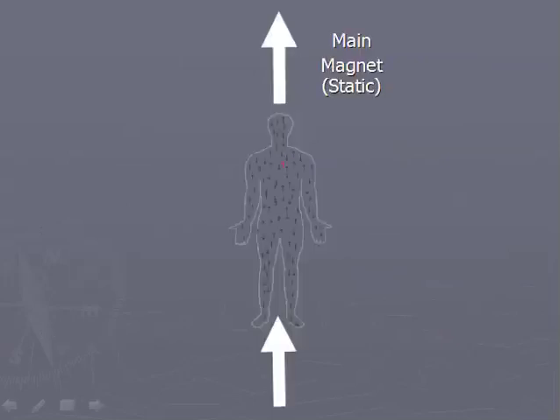Slide 13. This animation shows an extremely simplified depiction of what occurs with an MRI scan. The body has untold billions of hydrogen atoms, each of which contains a polarized proton in the nucleus. A very strong magnet, the main magnet, is used to align these hydrogen protons, with roughly half in one direction and half in the other, canceling each other out. But it's never quite 50-50.